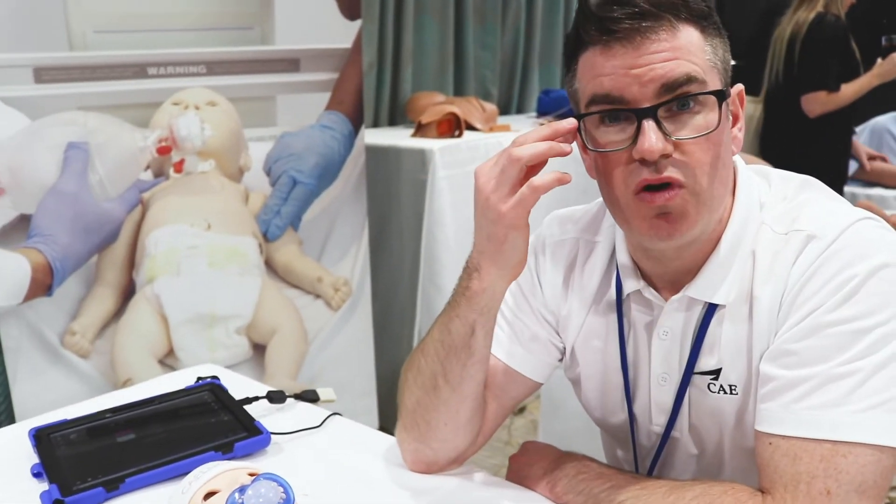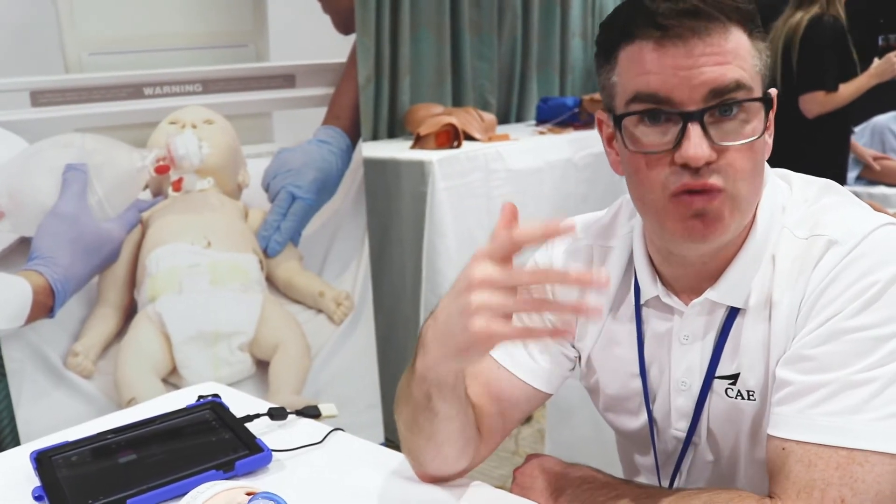Luna has a whole host of features. We can adjust the lunar fontanelle so it can be bulging or sunken — we can change it depending on what scenario you're running. We also have tri-state pupils so we can scroll the pupils across and have blown, pinpoint, or normal.